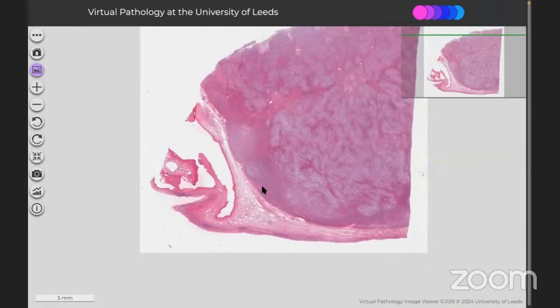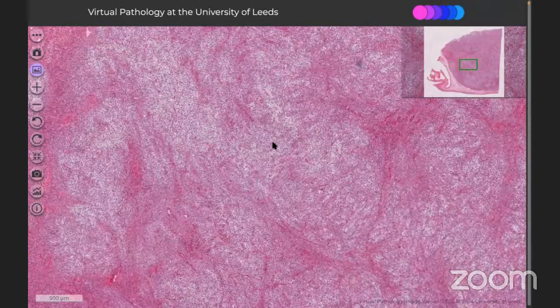To differentiate it from adult granulosa cell tumor, which is more common in this age group, you can do a reticulin stain. In reticulin stain, adult granulosa cell tumor will show the clustering phenomenon. That is, all the lesional cells will be wrapped around by reticulin clusters, and all other sex cord stromal tumors will have individual cell wrapping, that is the pericellular reticulin staining pattern. So this is the importance of using reticulin, and it is appreciated in any exam.